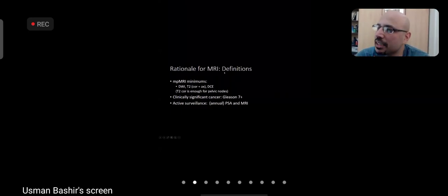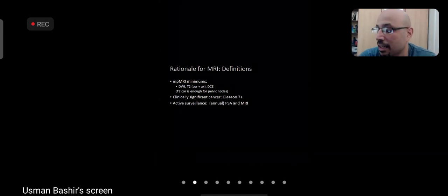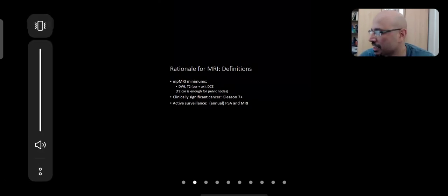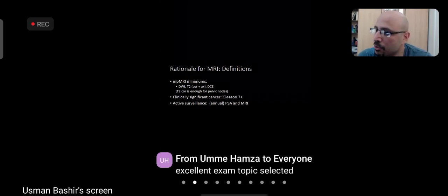So why do we do this? So, rationale. A few definitions first. Few things we must know. Look, guys, I'm assuming that you're preparing for FCPS exams, and hopefully you're going to go into practice and you're going to be encountering prostate MRI, right? And you will be working with urologists in devising a treatment plan for the people who have MR. So there are a few minimums that you must know as practicing radiologists, and also for the sake of your exam. One, these are three critical keywords in prostate imaging.